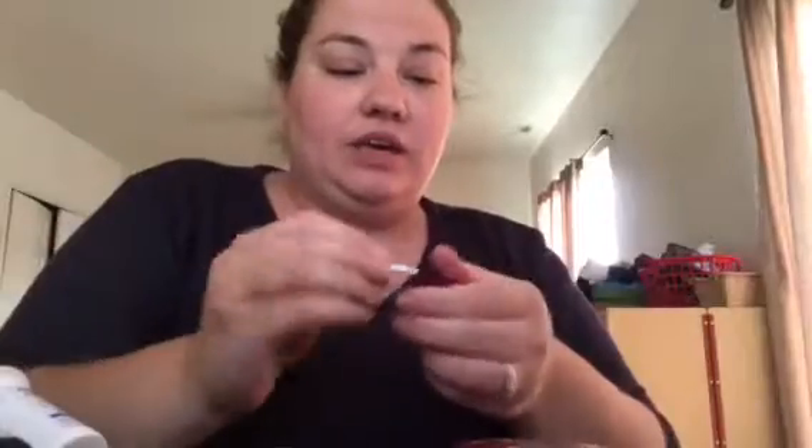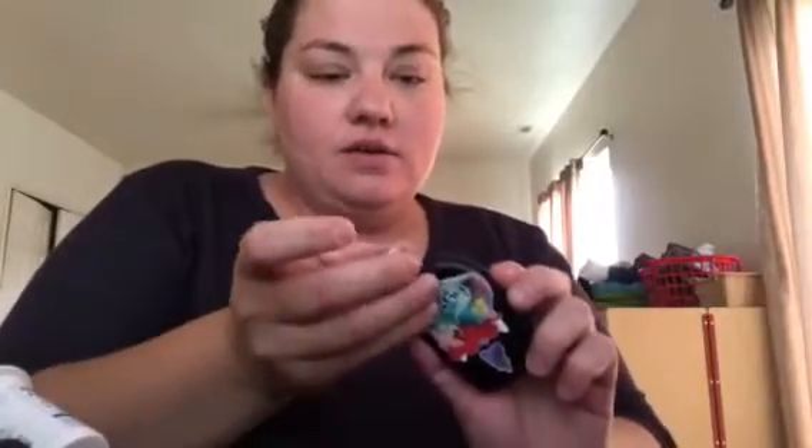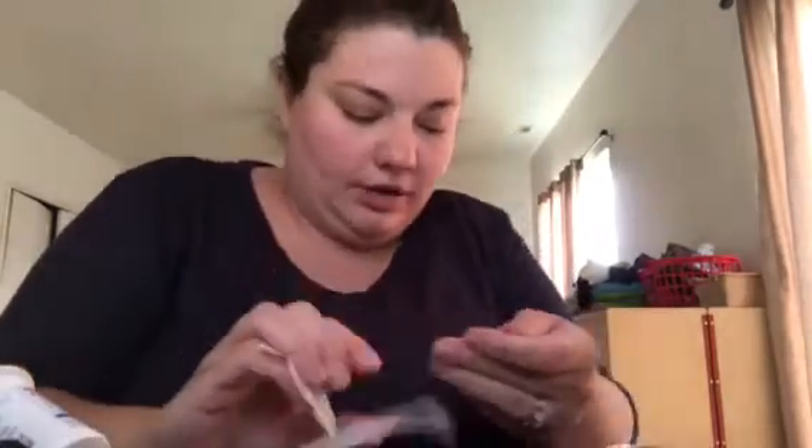Hey guys! So I was going to show you how Avia does with blood checks. It's time to check her blood before she eats. We check it before she eats, an hour after she eats, and two hours after she eats. And if it's still high at two hours after, I usually check it at three hours just to make sure.